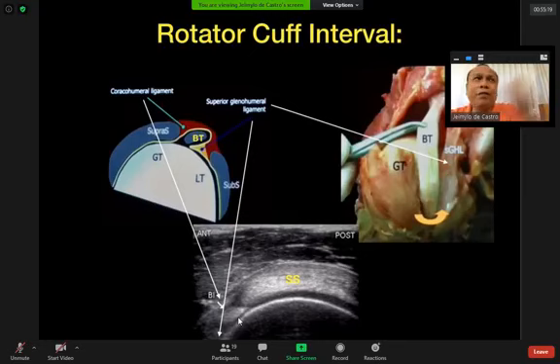ligament. If you will notice, the biceps tendon is found at the bicipital groove. There is also a ligament right on top of that area, which we sometimes attribute to be the one that holds the biceps tendon to stabilize it from moving out of that groove, which is the transverse ligament. But in reality, the one that really holds and stabilizes it is the coracohumeral ligament, so that any injury on that particular ligament can also affect the mobility of the biceps tendon back and forth on the bicipital groove.